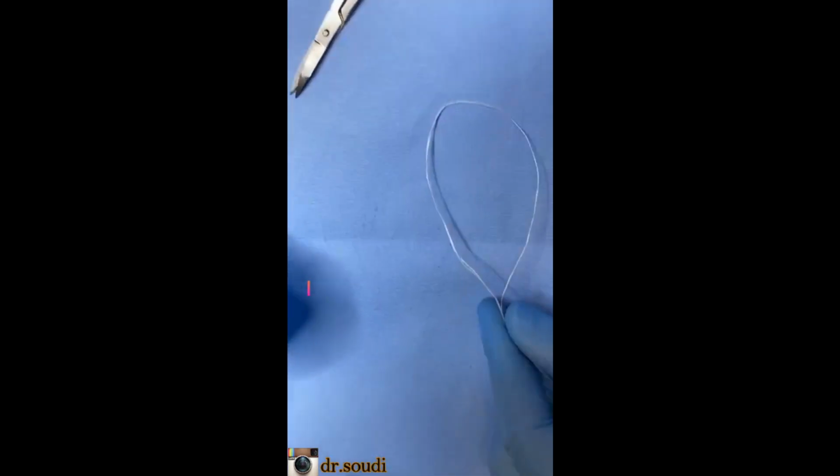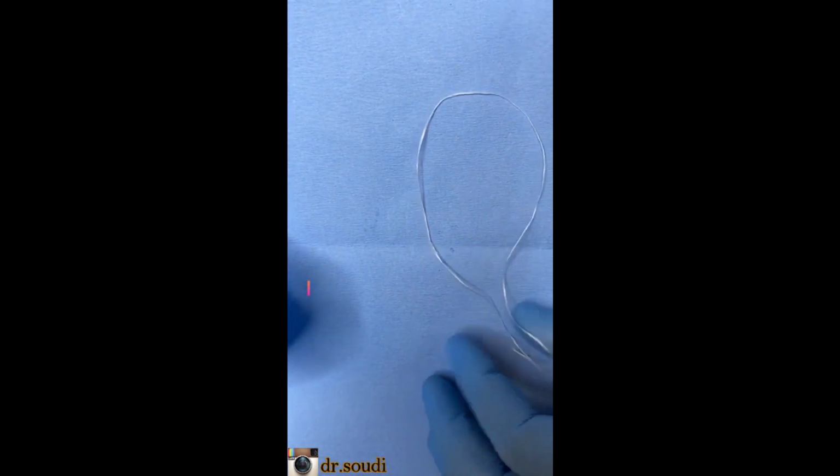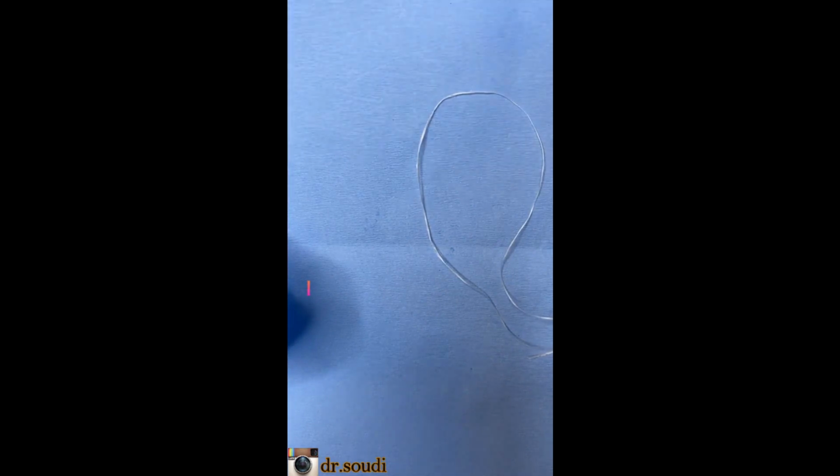Last thing, we will talk about the floss tie. We got two ties. Okay, mainly I use ties for the anterior portion, or if I have a lingual cavity.